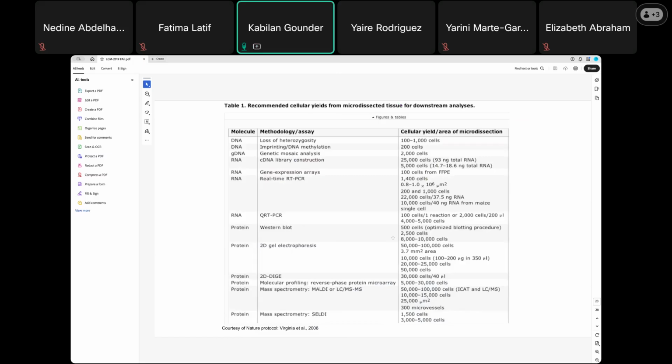As I mentioned, with the laser capture microdissection technique, you can isolate a single cell from a heterogeneous mass of cells. But the number of cells required to isolate DNA, RNA, or protein is not just one single cell; one cell's DNA or RNA is not enough to analyze with all these techniques. So how do you achieve this when you collect more than one cell? When you observe under the light microscope, you can pick similar structures of cells and then collect them in a tube for analysis, or you can use any other sources to isolate the cells.